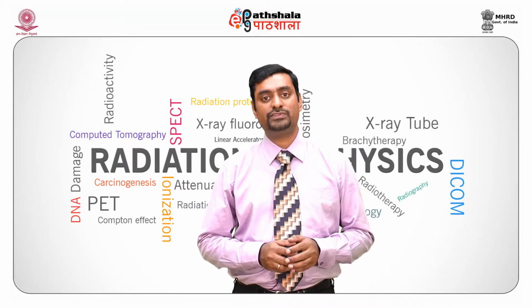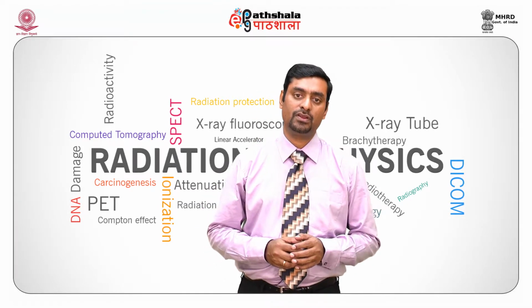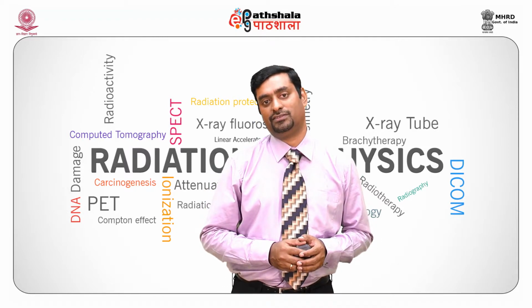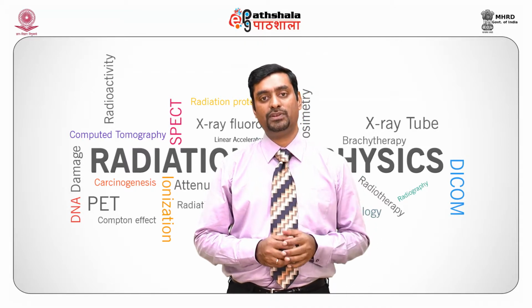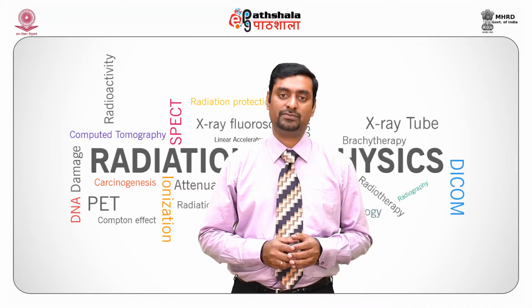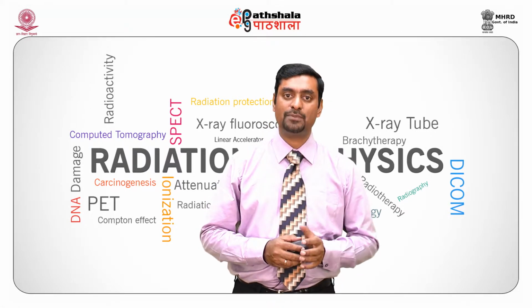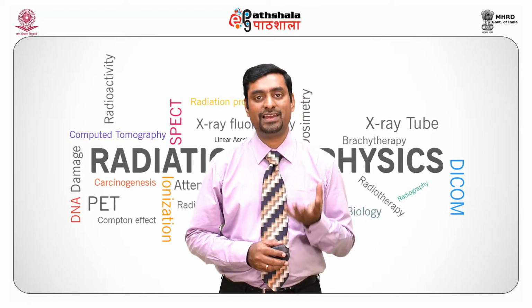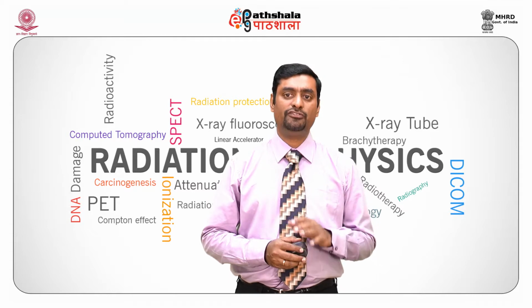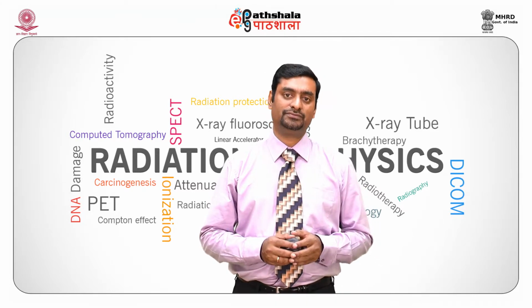Next, we move on to direct flat panel detector. All this while we were seeing how the indirect method is working. May it be a film screen combination or a CCD based device or an indirect flat panel detector, they use light to form an image, except in some cases where films can be used directly.